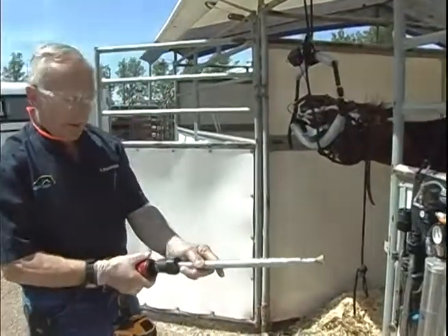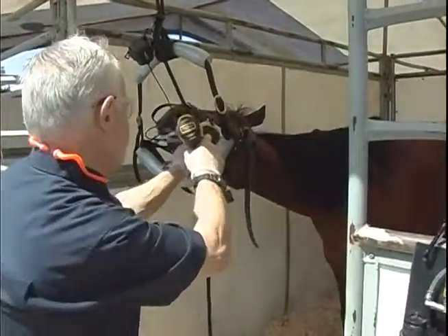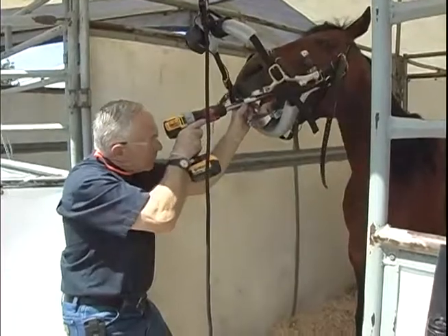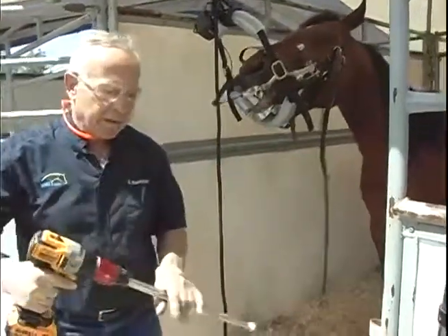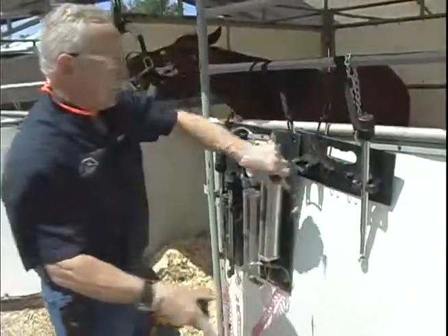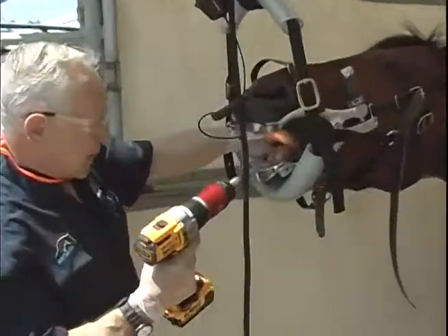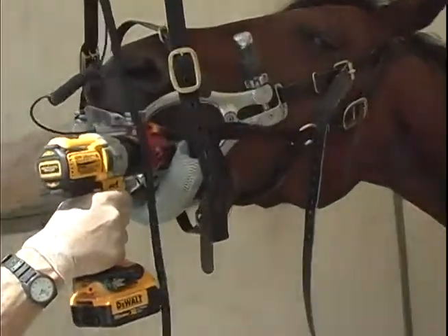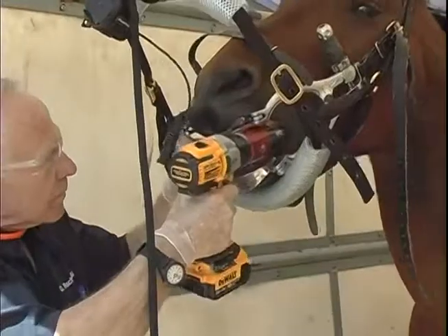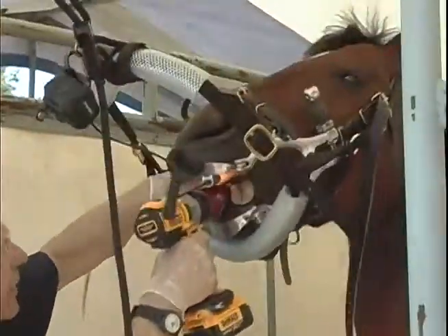Now I'm going to use the upper 11 to get the back edge of the upper teeth. I go diagonal over the tongue to access the last upper tooth. And that's about how quickly I'm able to get any small hook off the upper 11. Now going to use the apple core for the front lower bit seat. I push out the cheek. Now I lift up the tongue and I come across to this side. And I finish the front edge.